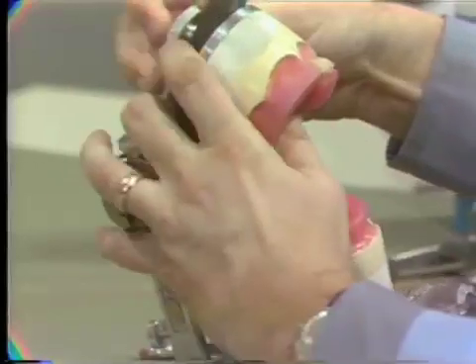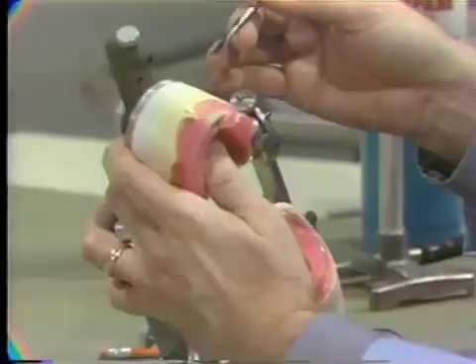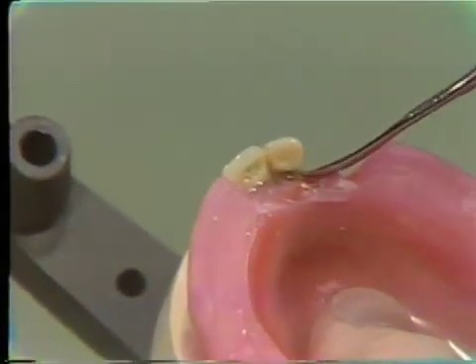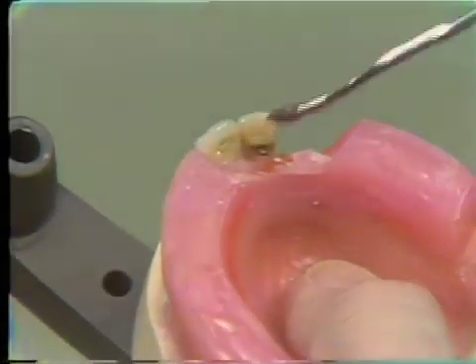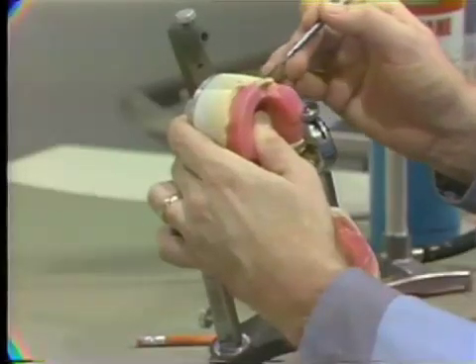Now, to make that adhere a little bit better, even though these lights are warm and I have no trouble at the moment, I'm going to flow just a little bit more wax around the neck of the lateral, trying to keep the wax off the surfaces of the teeth if I possibly can, because it all has to be removed eventually, so don't get wax up under the surfaces of these teeth. And if that pin on the lingual surface is covered with wax and allowed to cool, the tooth will have enough adhesion. It will stay in your setup.